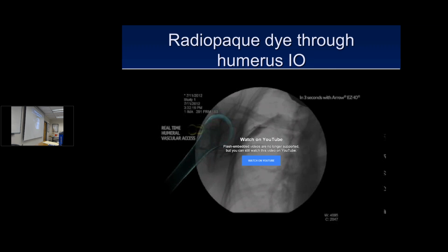What's the downside to this? Not really. Typically in a cardiac or CPR situation, that's where everybody's looking, in terms of this. So the opportunity to lose this along the way is probably the most common. But if you want the best location of the three, it should be this. You should be really, really careful about this.